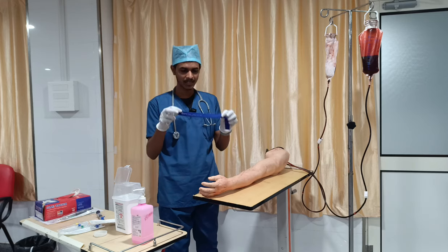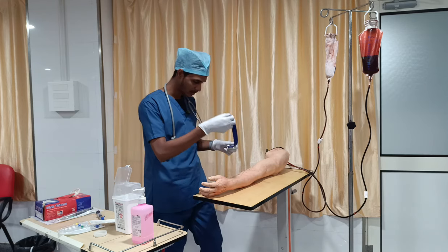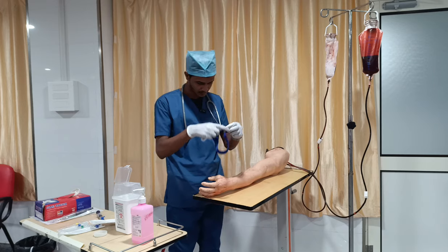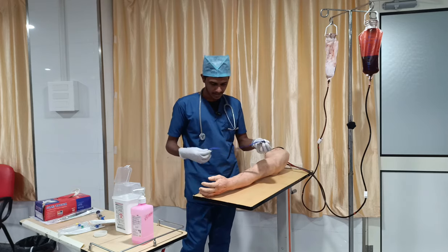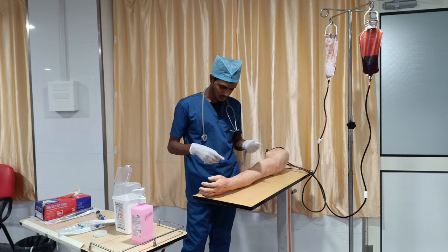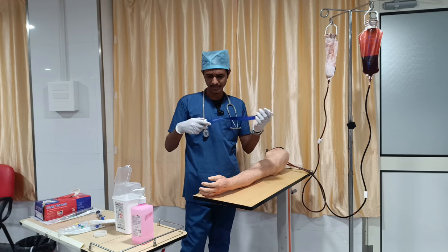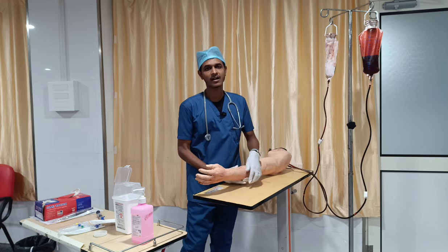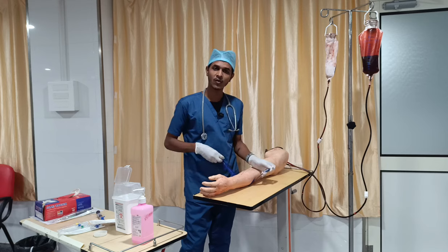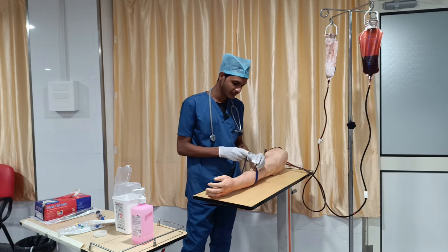This is called the tourniquet. It should be flat and elastic. So I am going to apply the tourniquet. First I selected the site. Here I am going to insert in that region, or you can go with a metacarpal also. About the tourniquet, you have to remember that you have to apply it 10 centimeters, or 3 or 4 finger breadths, above the insertion site. So that is the ideal location for your tourniquet.